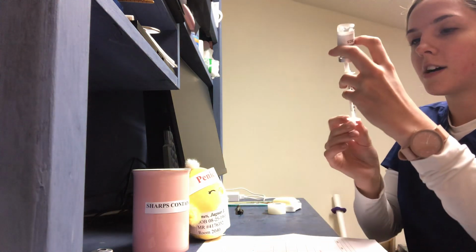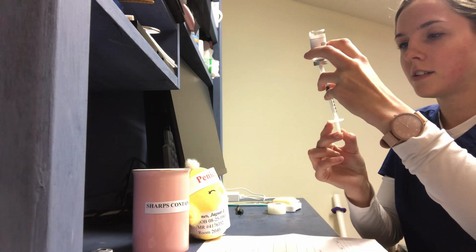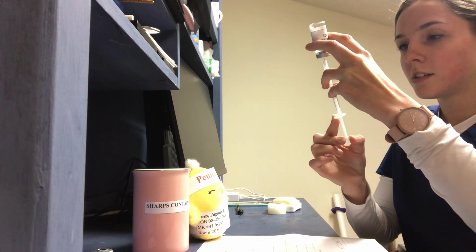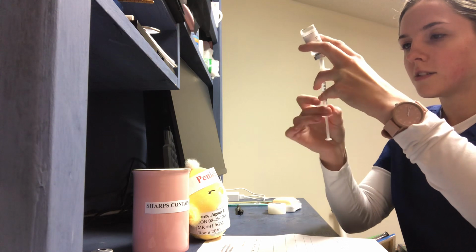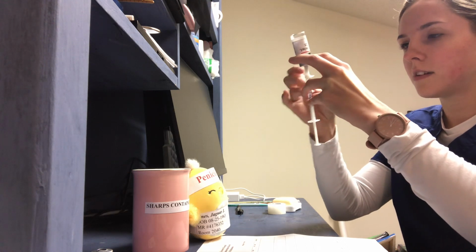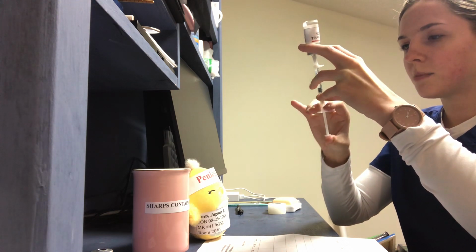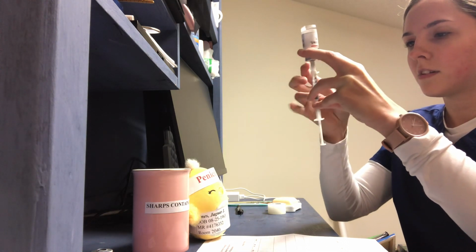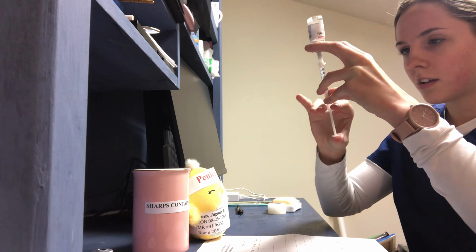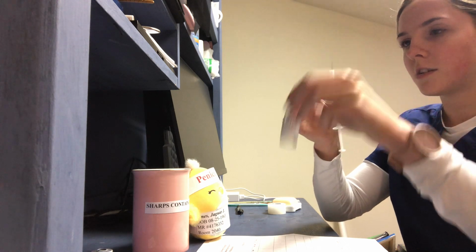I'm going to draw up slowly half a milliliter of solution. We want to avoid getting any bubbles. We want to avoid contaminating the plunger. We can draw up extra solution if we need to, so that we can tap out these bubbles. Tapping out all the bubbles. Alright, I have half a milliliter of solution, no bubbles.